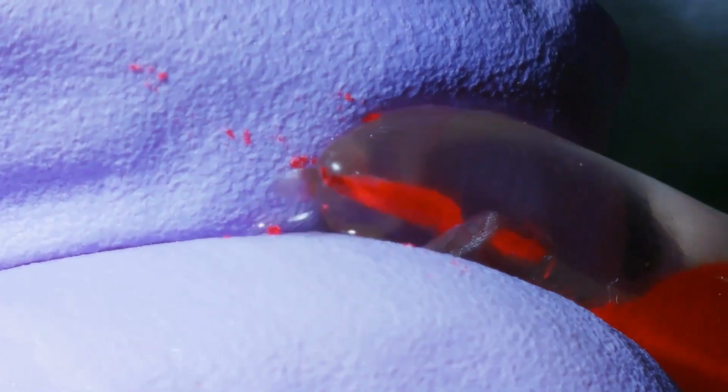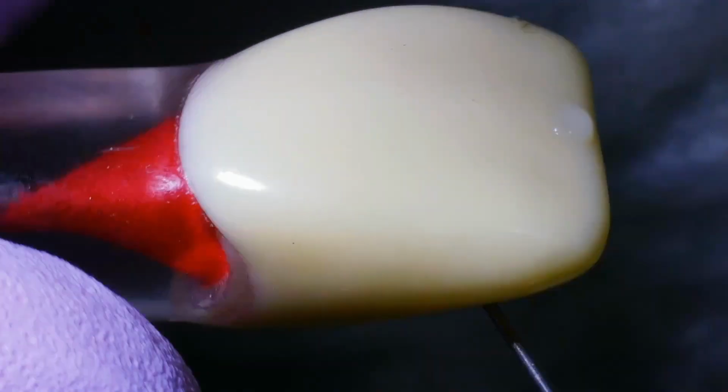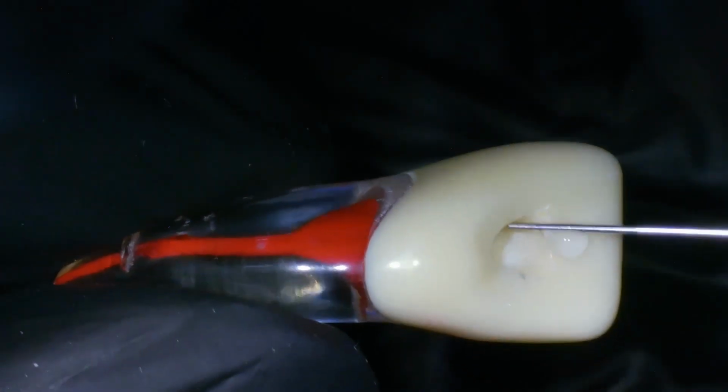Over-instrumentation can push debris into the periapical region of the tooth and excessively widen the apex, increasing the risk of a sodium hypochlorite accident during irrigation, especially if the needle is forced into the canal. For this reason, irrigation should be performed passively, with the needle moving up and down the canal.